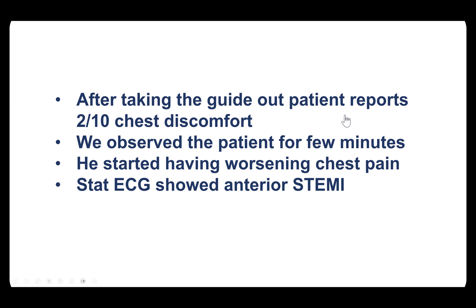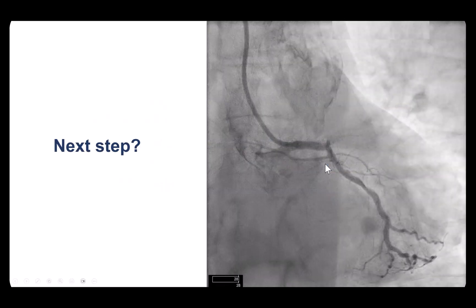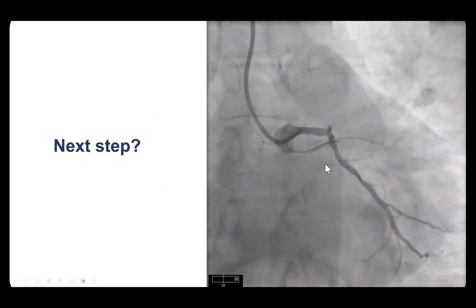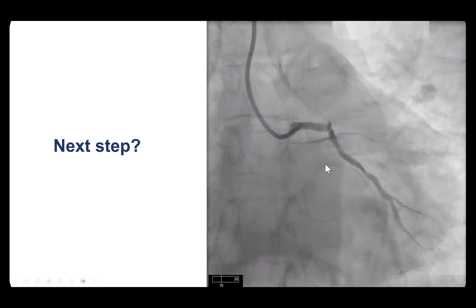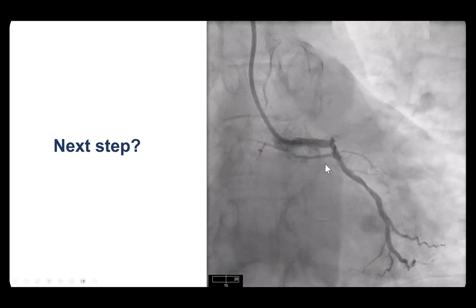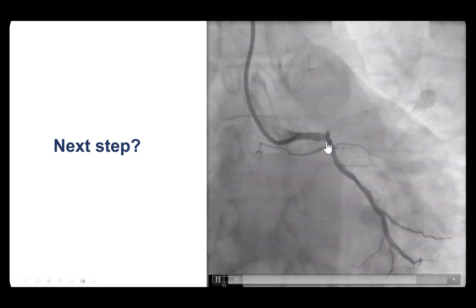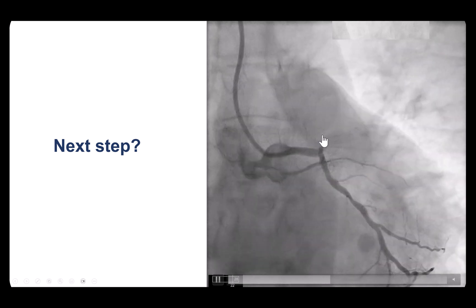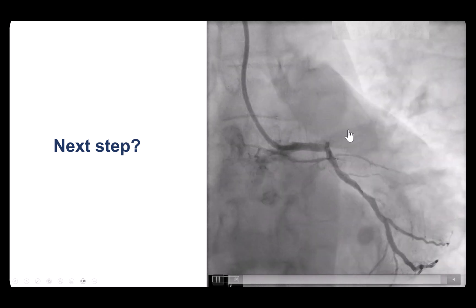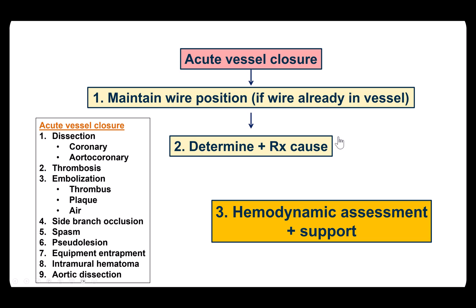The wire was pulled after good flow was seen in the LAD. However, after removing the guide, the patient started having chest discomfort and ST-segment elevation. Repeat angiography was done emergently, and what we see is acute thrombosis of the recently placed stent. The thrombosis is at the ostium of the LAD, and as you can imagine, the patient is not tolerating this very well.